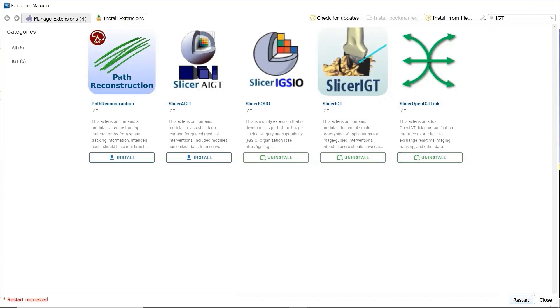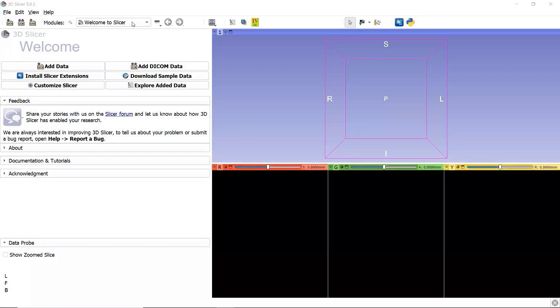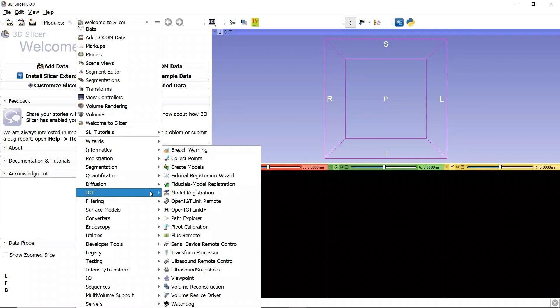Then we click Restart. Click OK. Now if we go to the module selection, we should see a category called IGT, which contains some ultrasound related extensions.